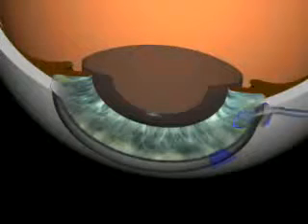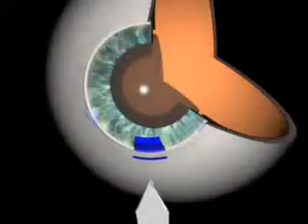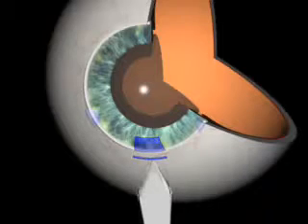Injection of viscoelastic. Once again, a viscoelastic substance is injected to fill the capsule bag for implantation of the IOL, the intraocular lens. Enlargement of incision. The incision is slightly enlarged to about 3.5 millimeters to facilitate implantation of the IOL.